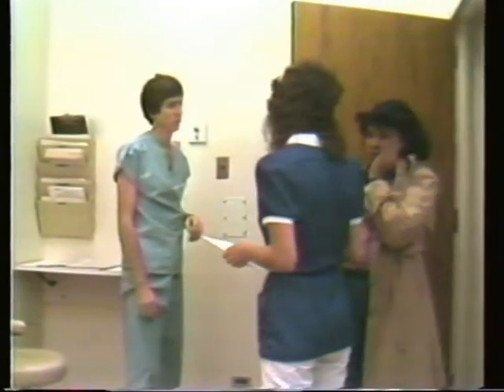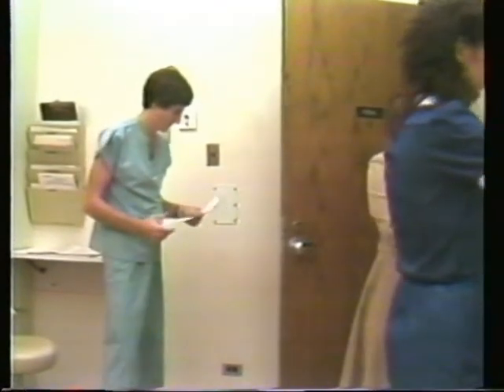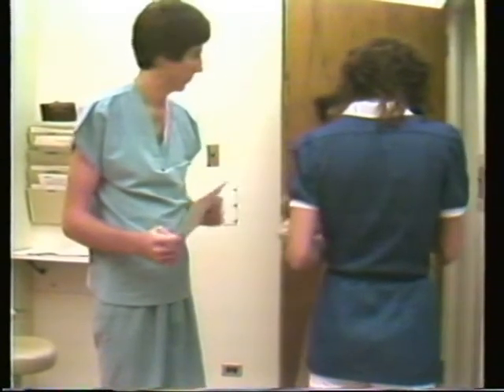Not bad so far. Note that the student is improperly dressed. He has no cap on and is wearing a watch. The chain of asepsis cannot be maintained this way.